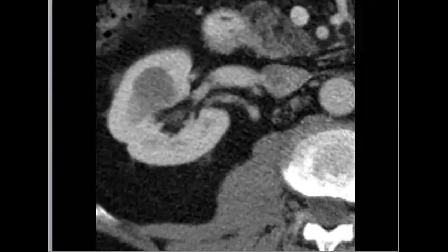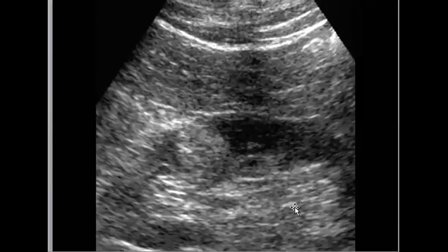Sure, the clinical thinking is good, but if you just see the image and you see a focal lesion in the kidney, which is indeterminate or maybe suspicious, or if you find any enhancement, it will be RCC until proved otherwise. Even in the ultrasound, sometimes it is hyperechoic.